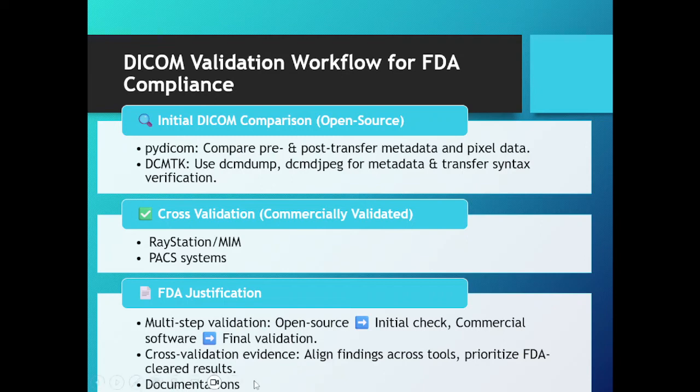And of course, documentation is very important for FDA. You need to have the design requirement document. You need to have the verification plan. Then you will have the verification and validation reports. You will also have a risk management plan, etc., etc.